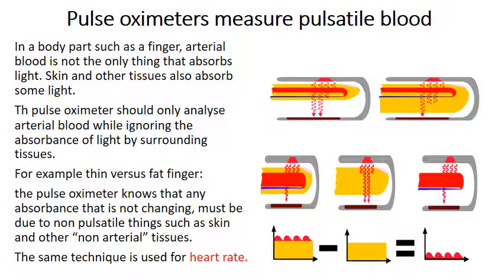However, there are some studies that indicate that pigment can play a role, and that is a concern in dark-skinned individuals that have hypoxia. Sometimes their reported pulse oximetry is higher blood saturation than they actually have. That is a very dangerous thing. It's actually a false negative. It's missing the fact that someone has low levels of oxygen. You definitely don't want to miss that. So there has been a paper published that this can be a concern in some dark pigmented individuals.